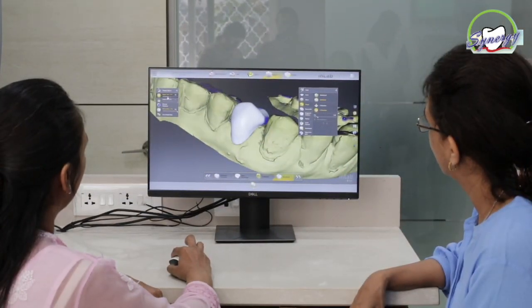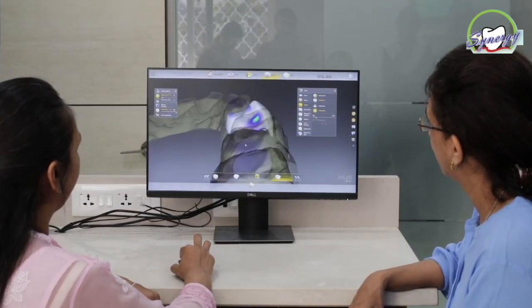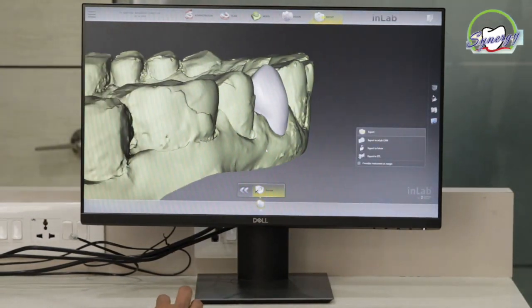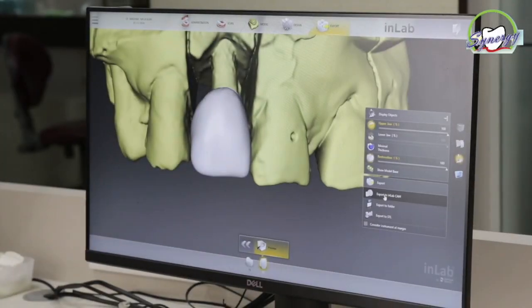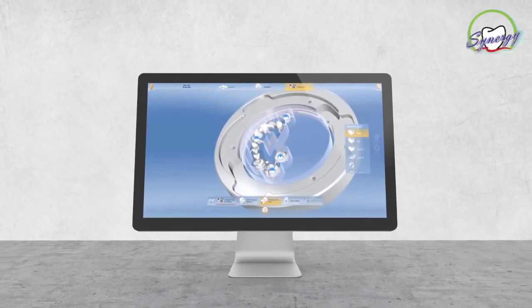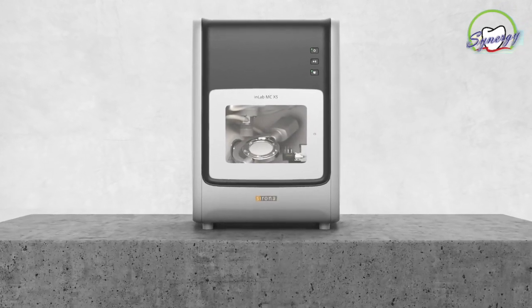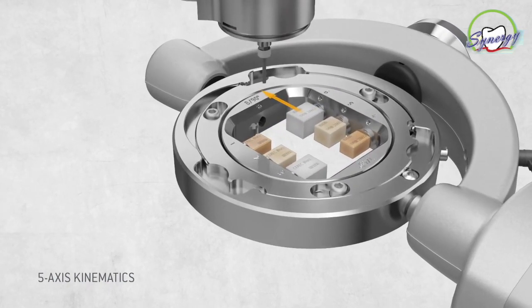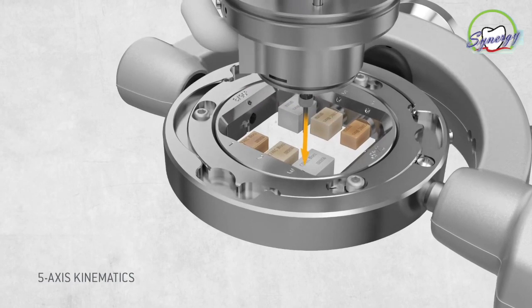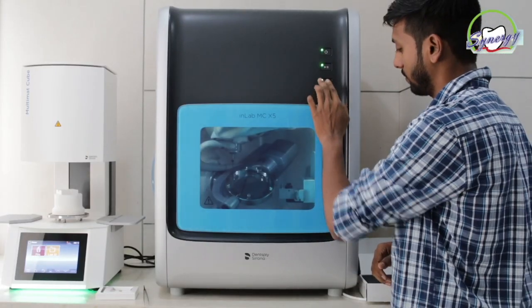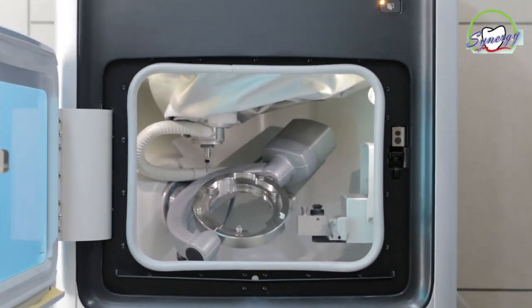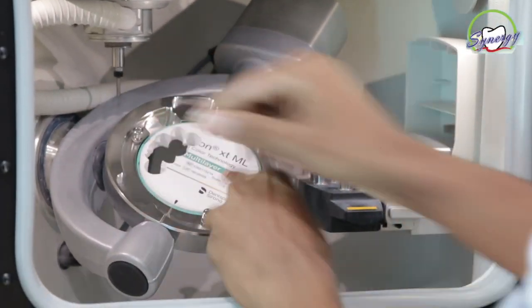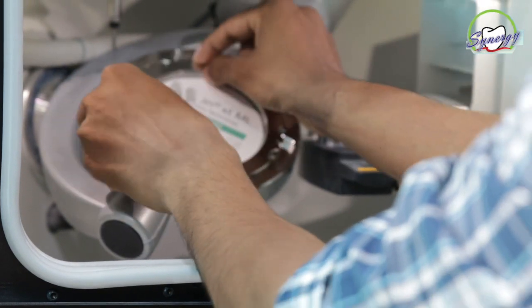We can also view the magnified restorations in profile view and in frontal view to ensure good aesthetics. Once designed, the restorations are then milled in the MCX5. The blocks or discs to be milled are fitted into the 5-axis milling machine. The MCX5 milling unit has been awarded the Red Dot Design Award for its high quality. It is able to mill single restorations as well as full arch cases and implant prostheses, providing end-to-end solutions for our patients.